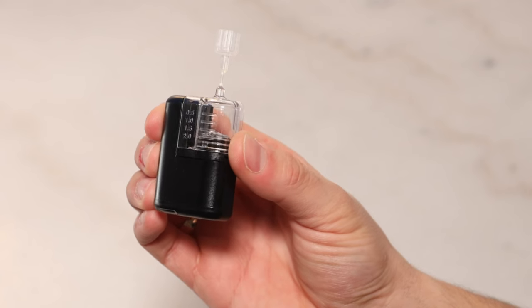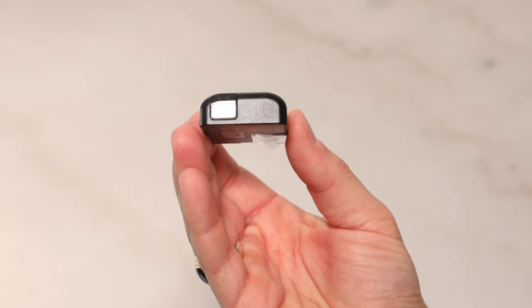Aside from the app, you can also get alerts, control the Mobi, and bolus by using its button and by viewing the LED lights.